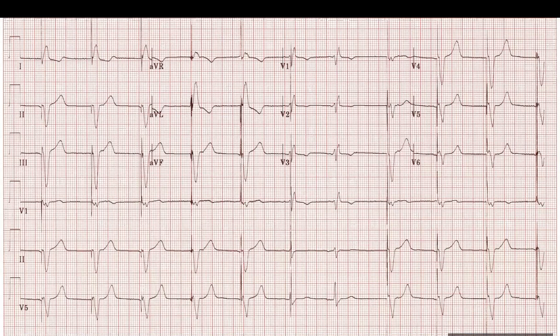If you're getting an R wave in V1 with that paced, there's a pacer spike before that, so you want to think about left ventricular pacing. But this is an intrinsic QRS. This is not the paced QRS. The paced QRS, you could actually see it in the one after. It's a little bit negative here.